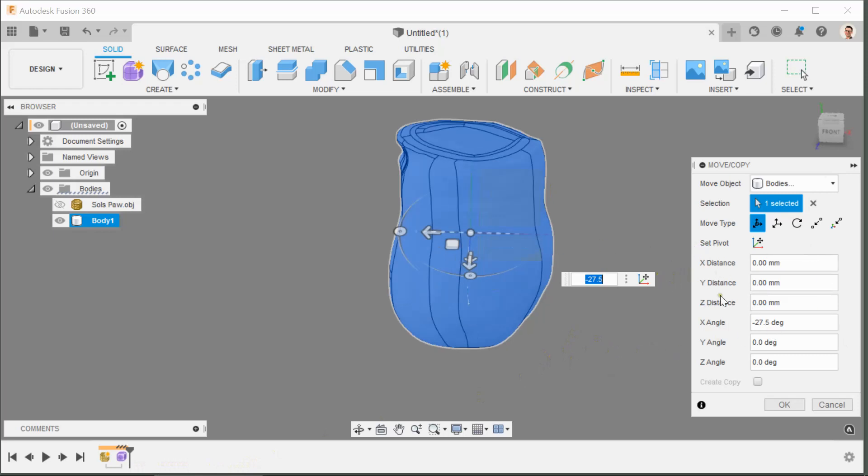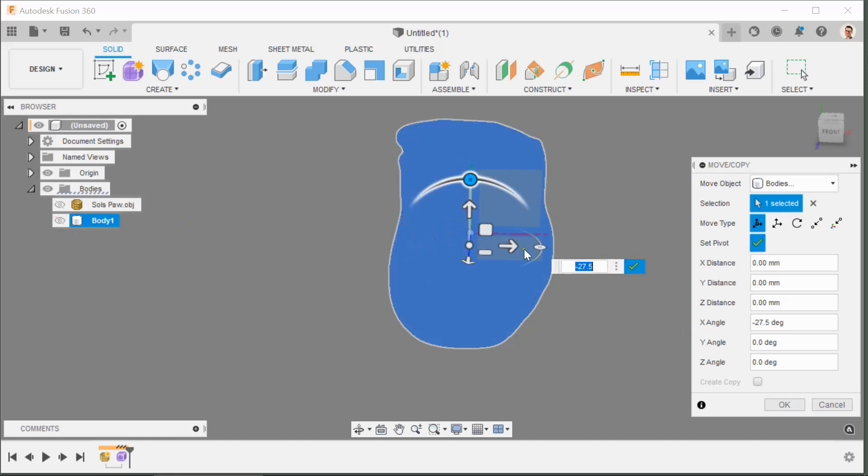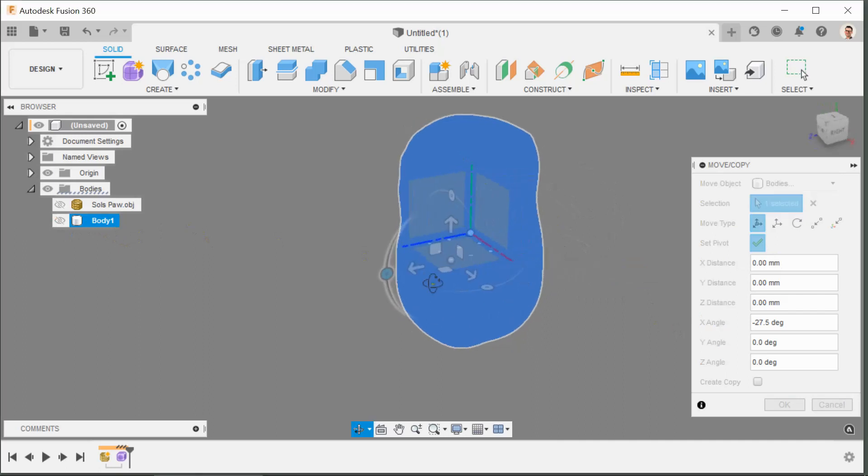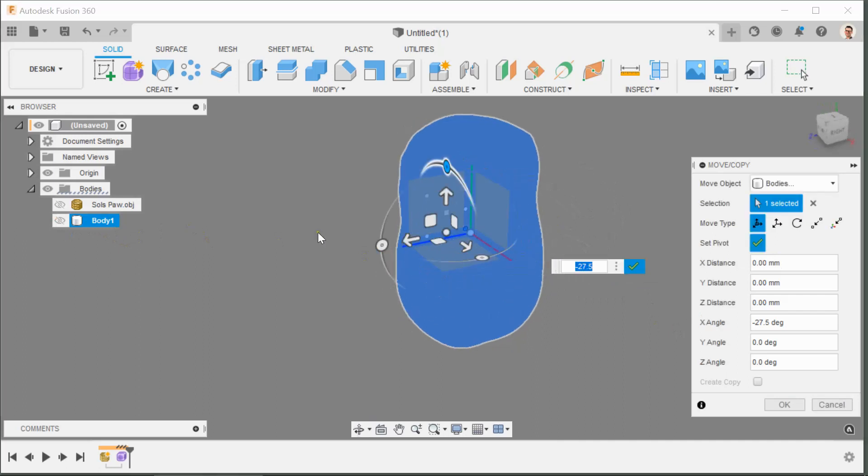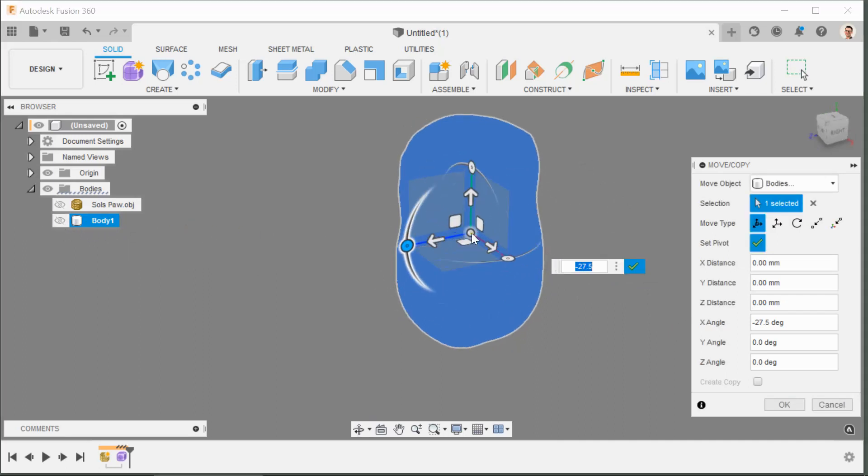And what I need to do again is select the pivot point. In order to access that origin that we've centered the body on, I need to turn the body off again. If I just turn the visibility of the body off, I'm going to wait until the white dot there snaps to center.